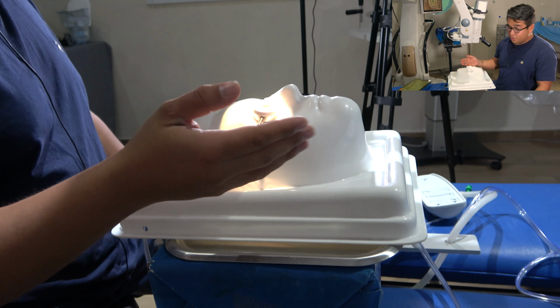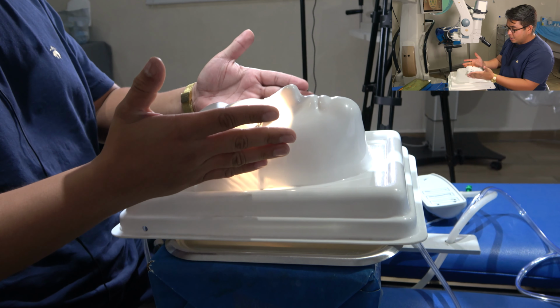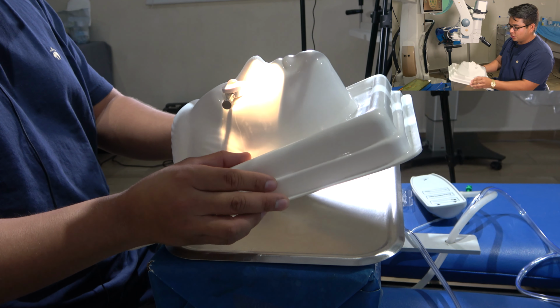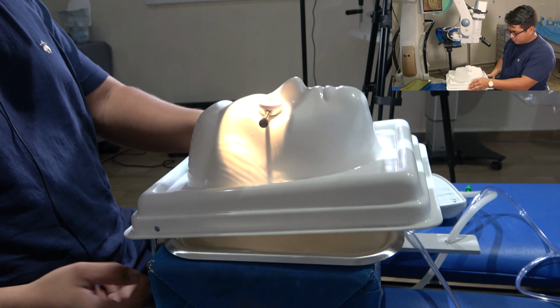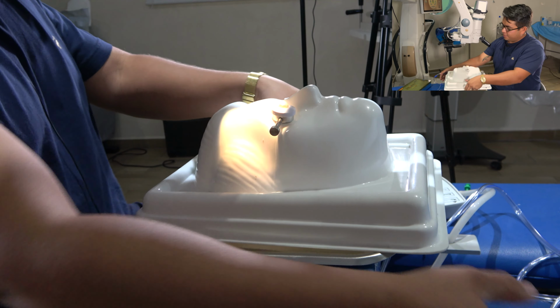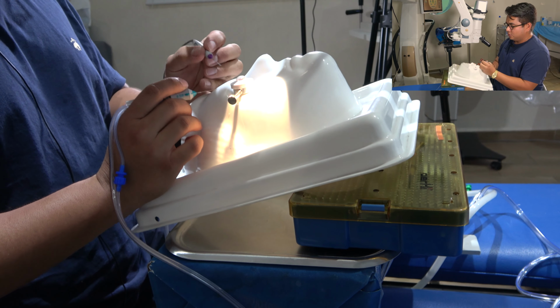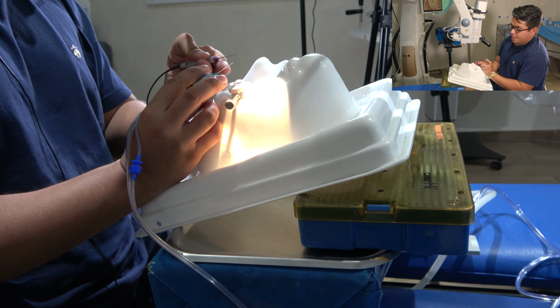For example, with a retinal detachment with inferior tears, it's really important that we have our patient in this position, because if the neck of the patient is in hyperextension here, and we have inferior tears, look at my hand position. If the head of the patient is in hyperextension, it will be really difficult for me to achieve the treatment of the inferior lesions. Okay, I must be like that.